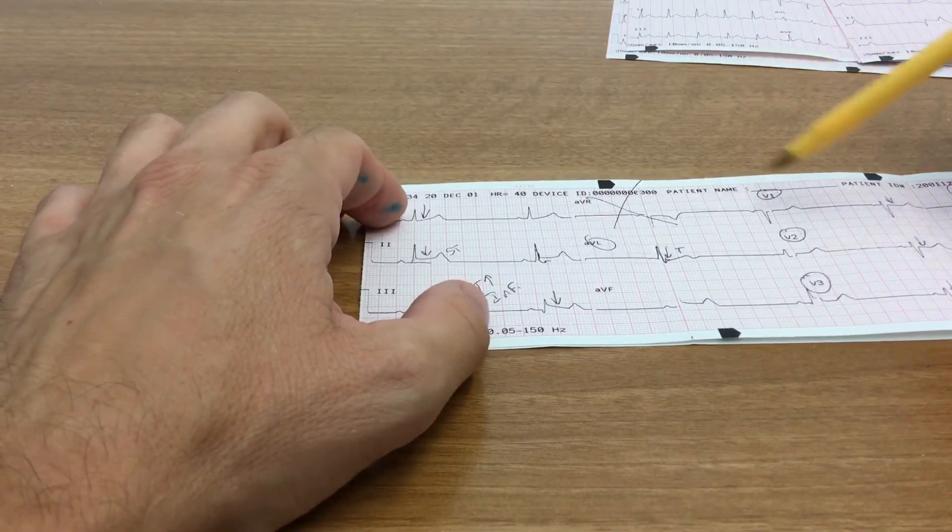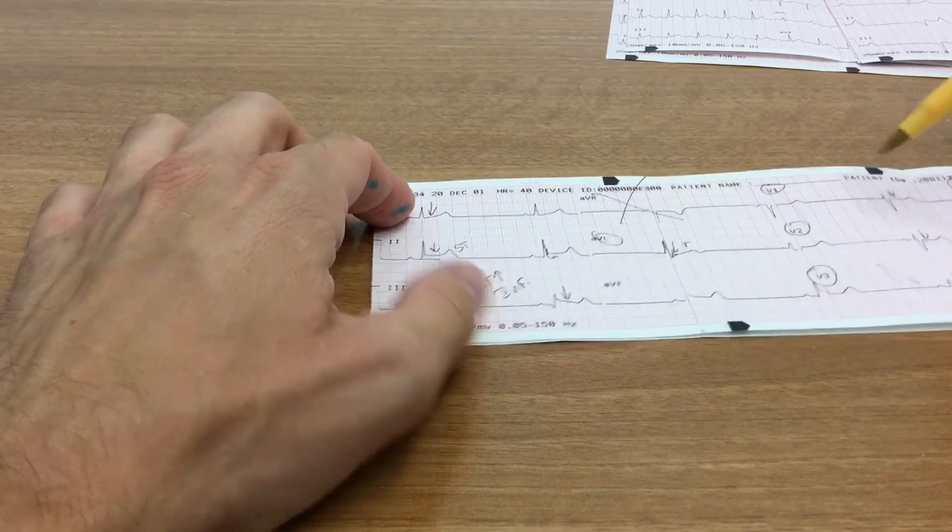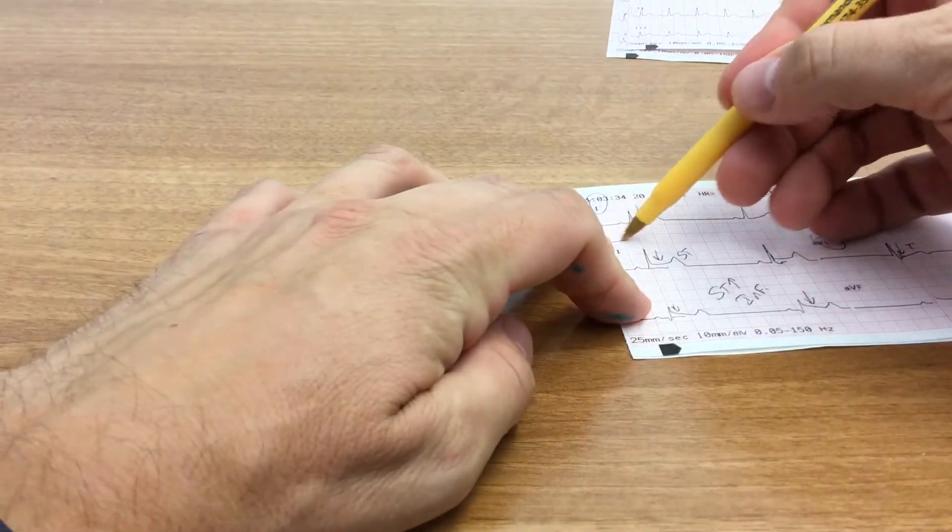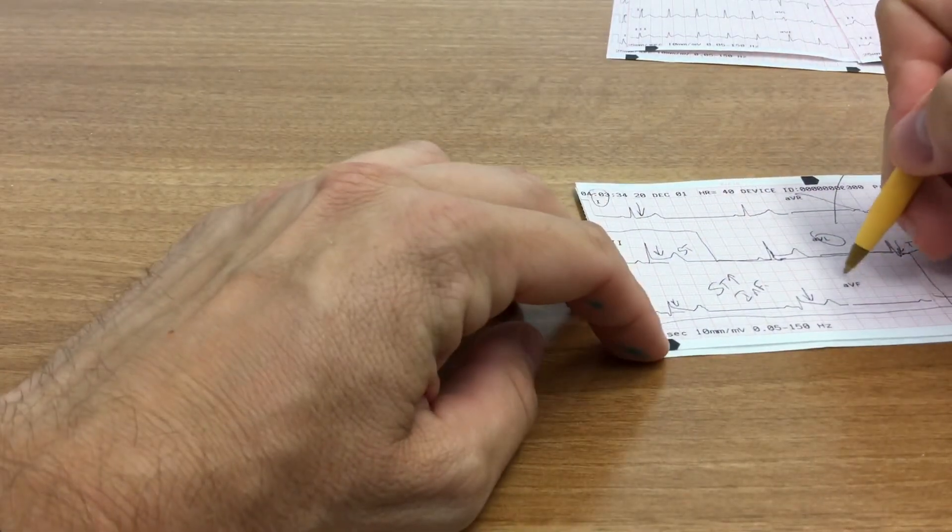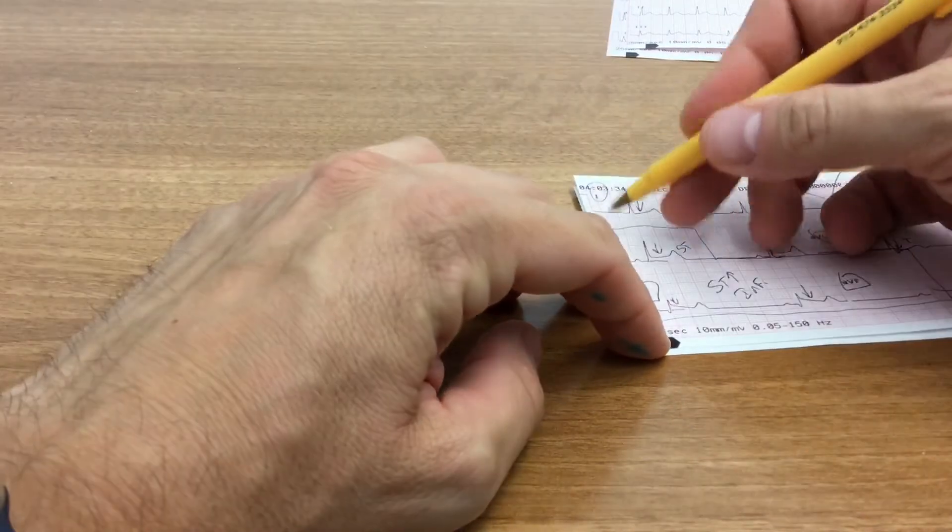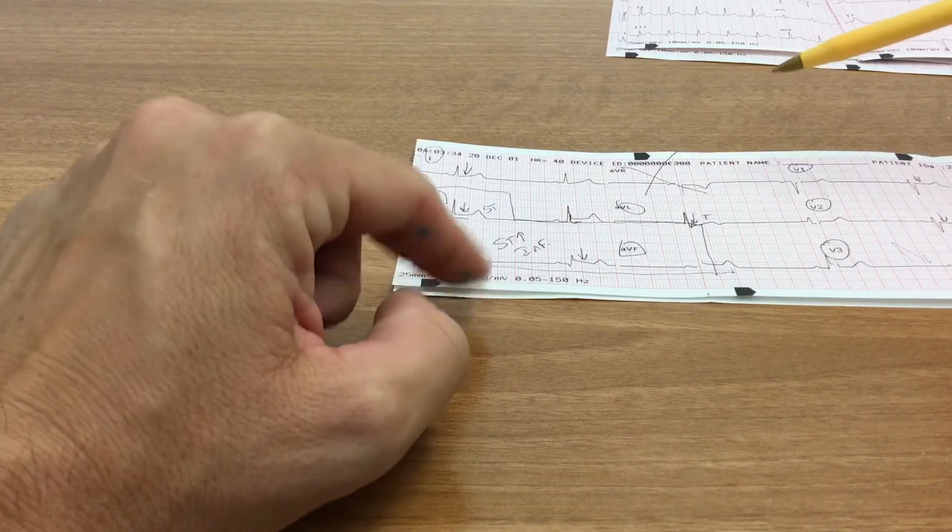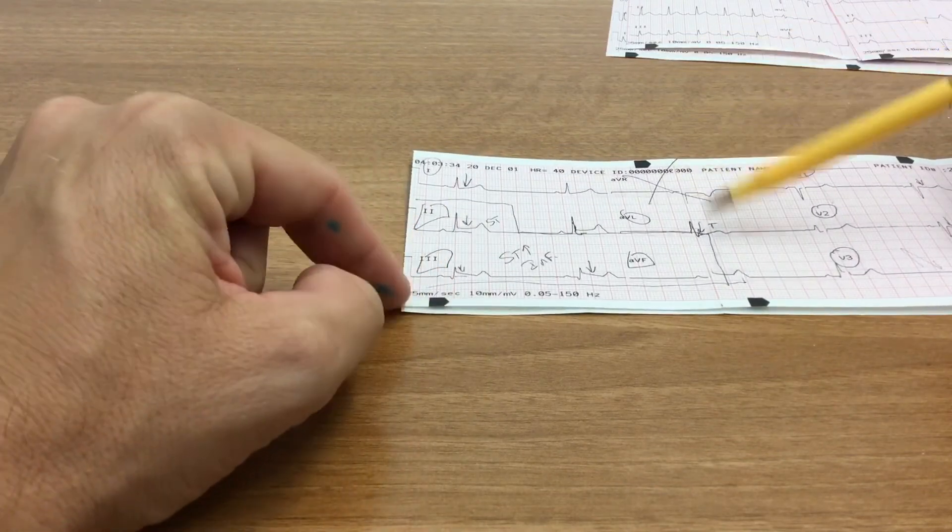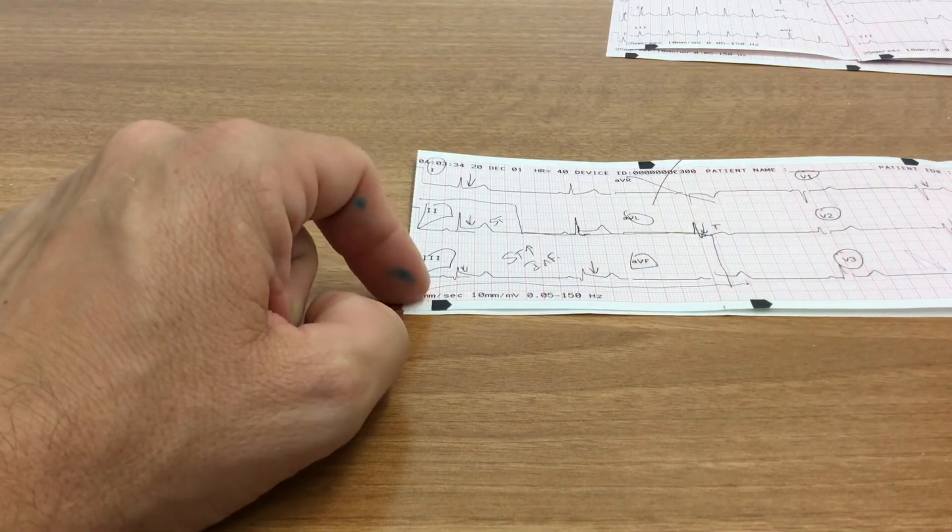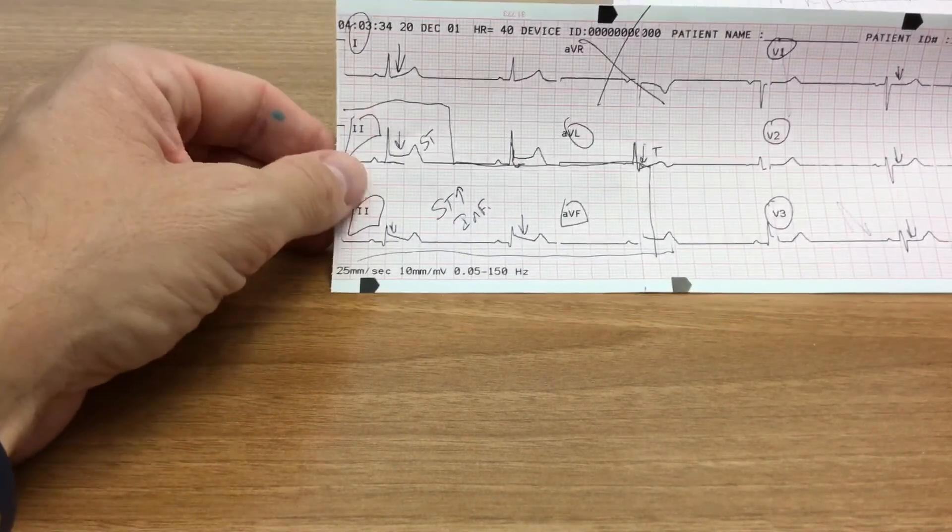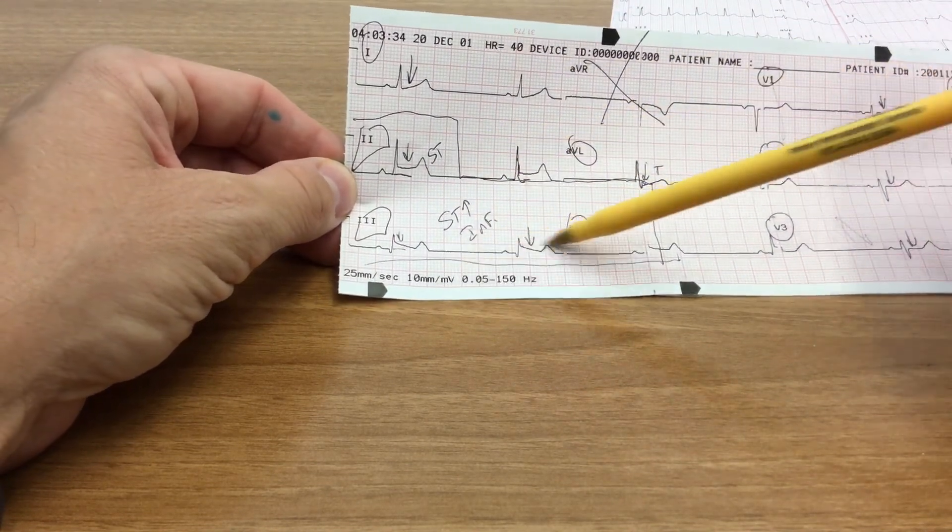So the anterior, septal, and lateral walls look okay. But we do have ST segment elevation in all three of my inferior leads. And so we would say, in this case, if our patient had signs and symptoms suggesting a STEMI or suggesting acute coronary syndrome, and we marry that with these findings, this is a very high probability that this patient is having a ST elevation myocardial infarction in the inferior wall.